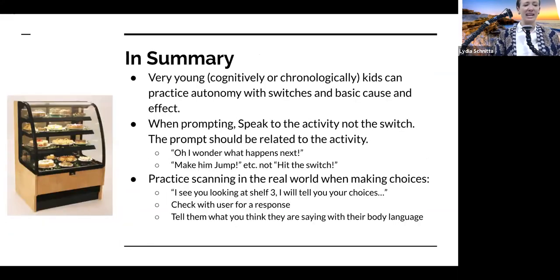And again, this is sort of an overview. I'm breezing through a lot of complicated things right now. And I'm going to get your feedback so that I can make this better and more meaningful for you or for future people. But in summary, I just wanted to let you know that very young kids can practice autonomy with switches, and that it's important that they do this. And when prompting, speak to the activity and not the switch.